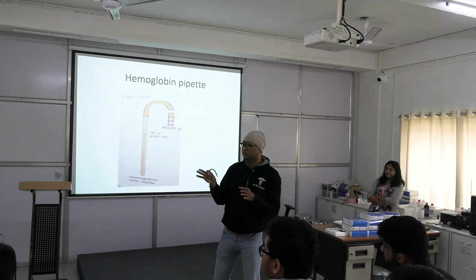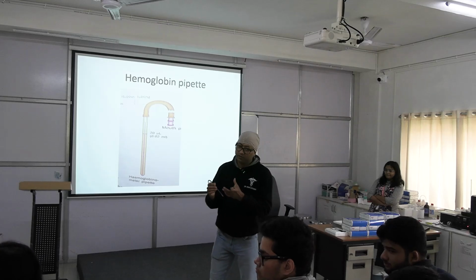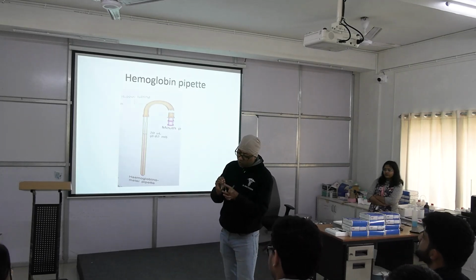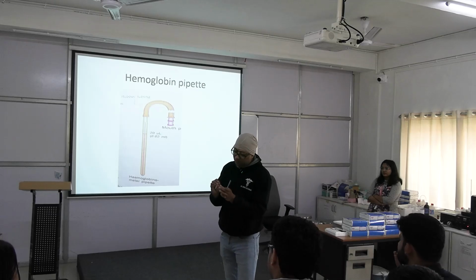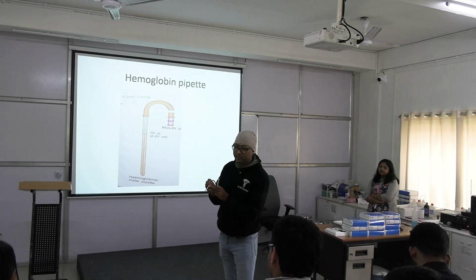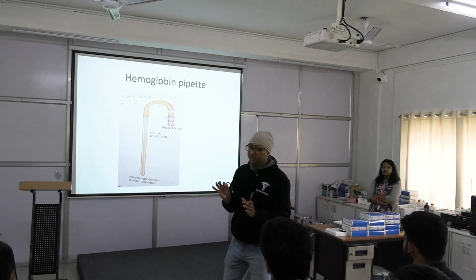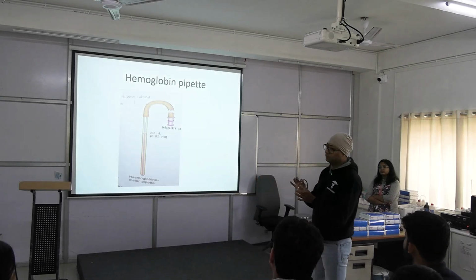So you need to take a drop of blood on a glass slide and you need to draw blood with your mouth up to this point, the graduation. And there are some precautions: there should not be any bubble inside, it should be a solid blood column.